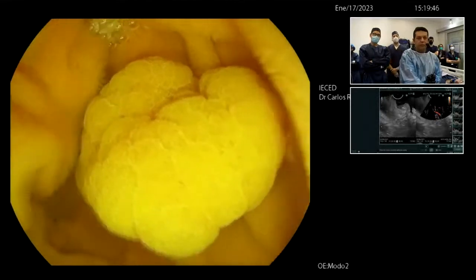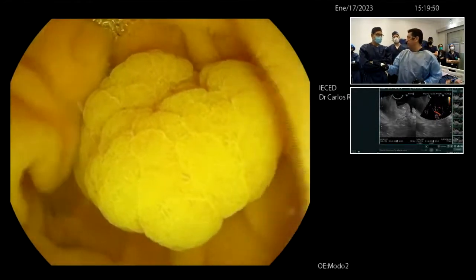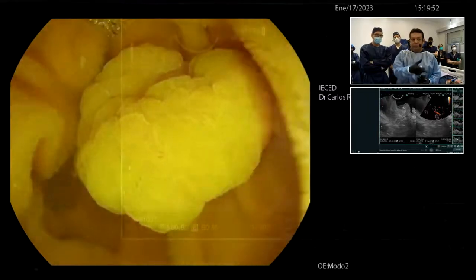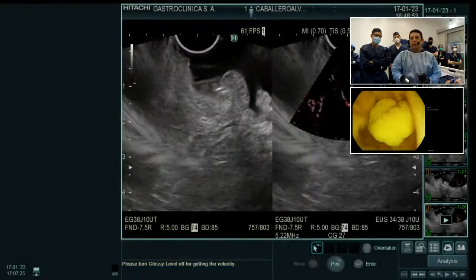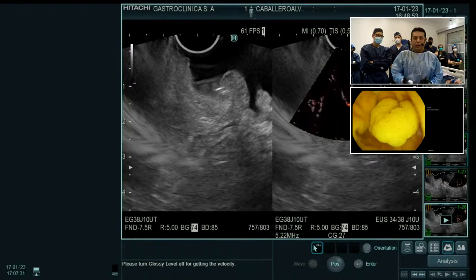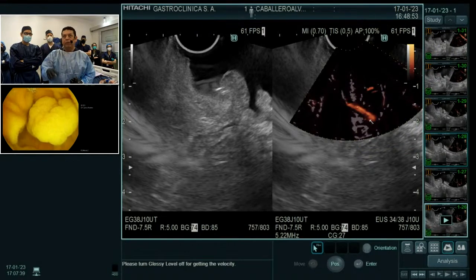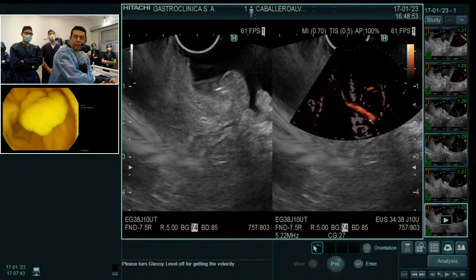You see here. So I believe probably in the future we can evaluate some polyps or some risk polyps and evaluate if this is a high risk lesion or not, and avoid a complication. And this is why I believe this technology, DFI, can help us to evaluate if the resection is something we can do. It's just to do some kind of prevention.